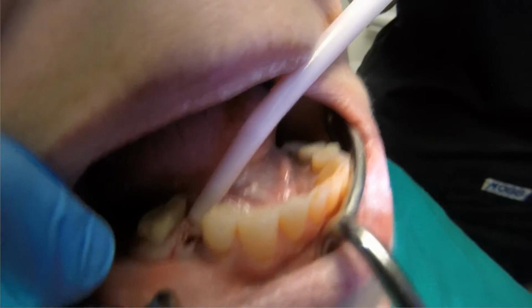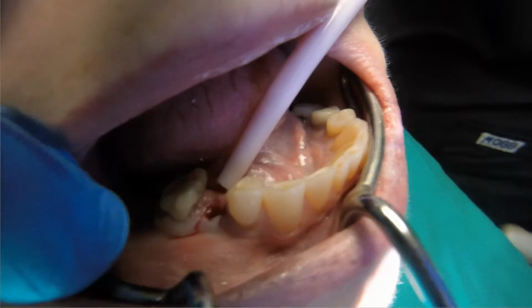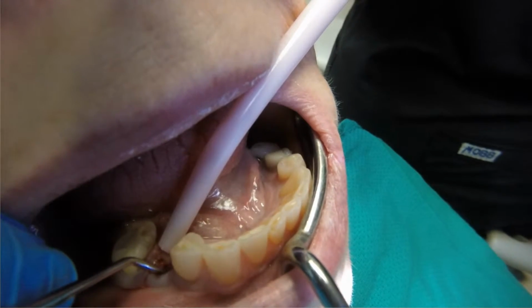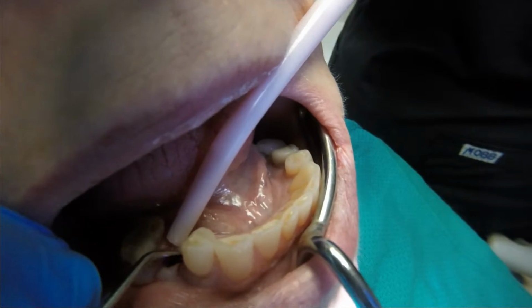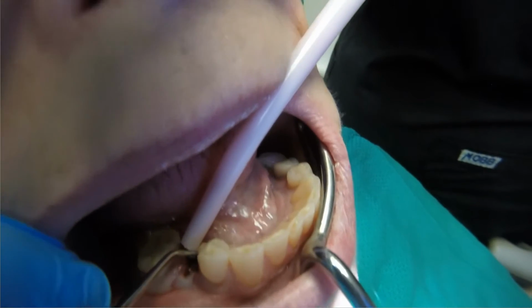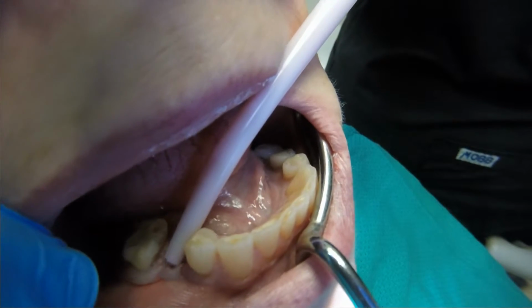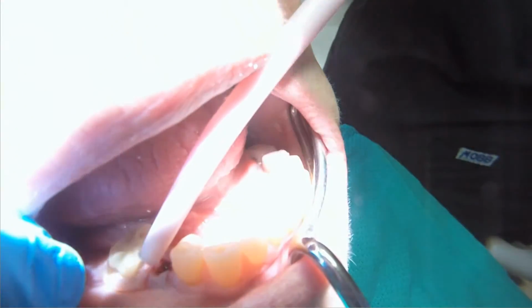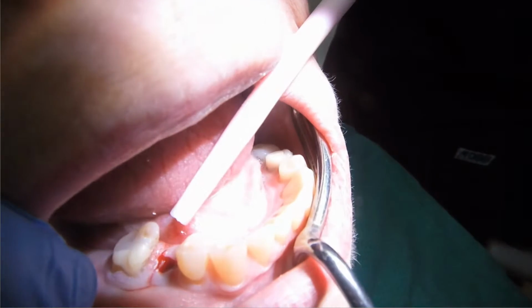We used a 15 blade on a scalpel, and now you can see I'm taking one of my favorite instruments. This is a Woodson elevator. It's got this beautiful almost 90-degree hook on the elevator head. It's great for just pushing full thickness flaps away. We're going to get a little bit of light here.